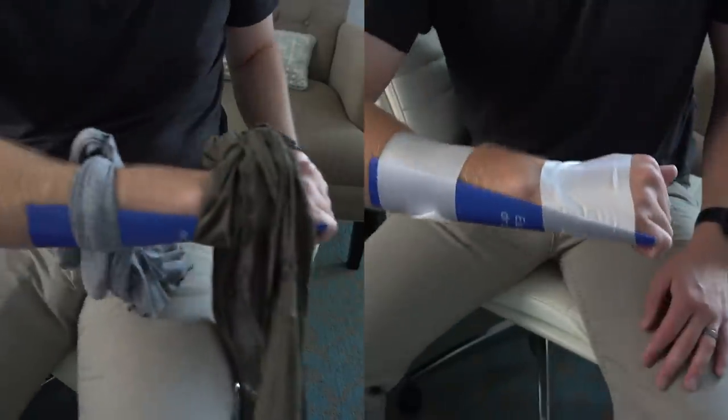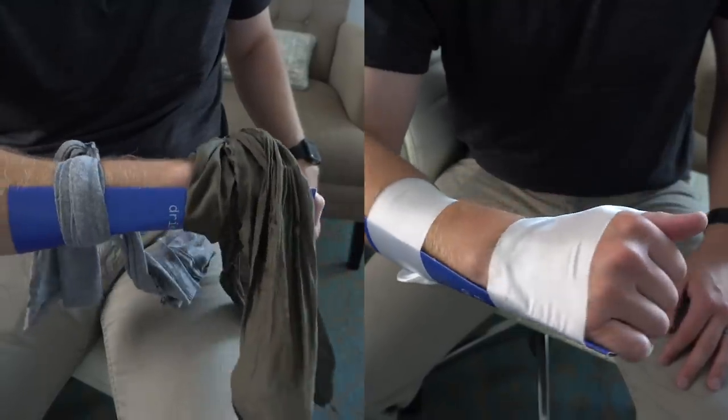The final piece of improvised medical equipment we're going to talk about today is splints. For this, all you need is some kind of brochure or magazine and either tape, some kind of fabric, or a pressure dressing. Take the magazine and fold it into kind of a boat shape. Take their arm — for this example we'll do a wrist — and put it on their arm just like you would a SAM splint. Once it's bowed up, it will not be able to flex up and down, which makes it an ideal splint. It's also not completely rigid like a stick or board. After that, take your tape or fabric or pressure dressing and secure it above and below the injury site — splinting the long bone above and below for a joint injury, or the joint above and below for a long bone injury.